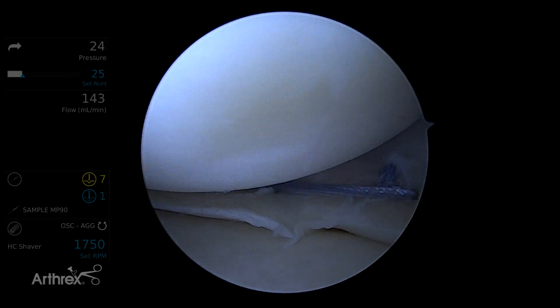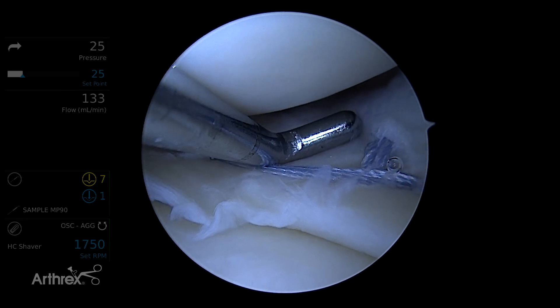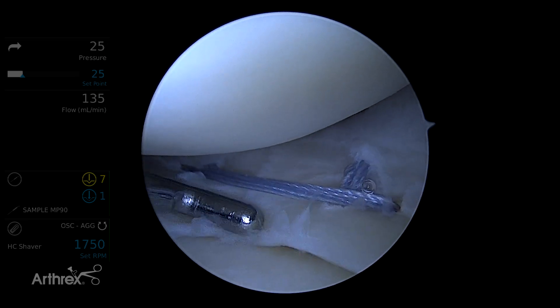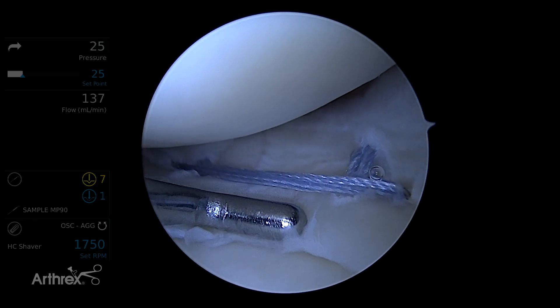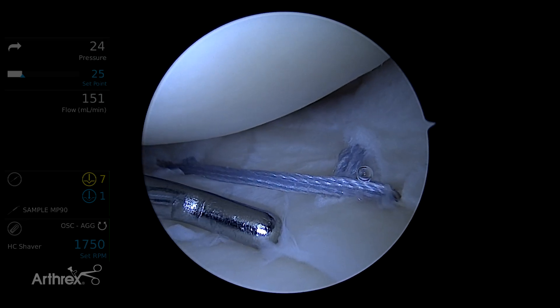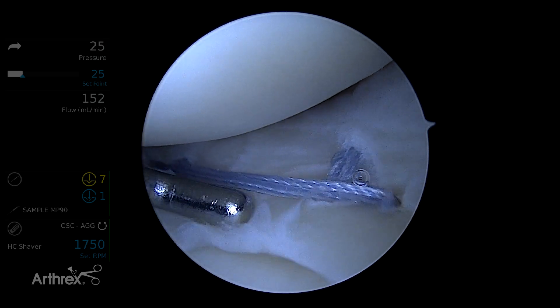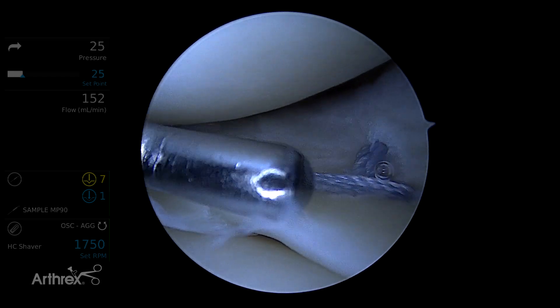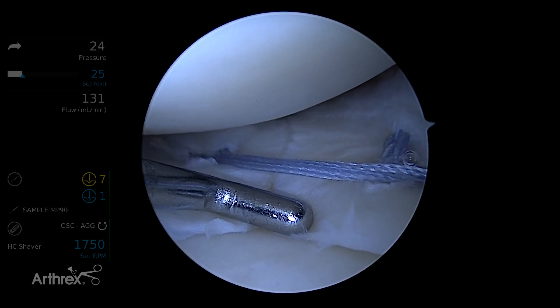Now that you've got a good repair, you can do the finesse work. I could put another oblique suture from up here and cross it down if you've got enough tissue. The question we always fight with clinically is, when is enough enough? What this has done for me clinically is make me realize we often put more and more sutures in radial tears because we think some of them may not be as good as others. This I know is good — I can pull on this and it's not pulling out. That's a strong stitch because it's reinforced here and here with the vertical ripstop. So less is more in a sense. We've got three anchors in, yes, but we've saved a meniscus, more importantly.